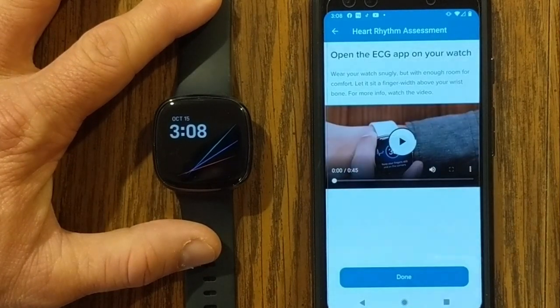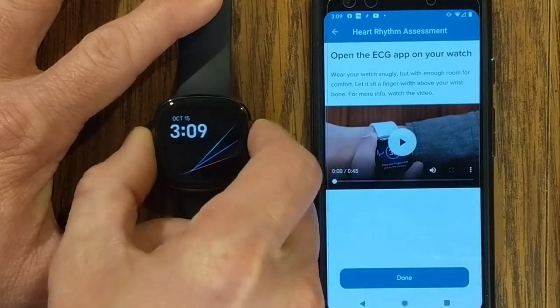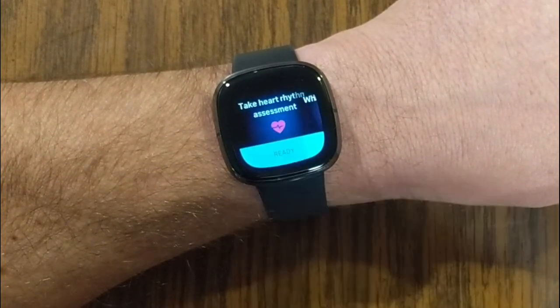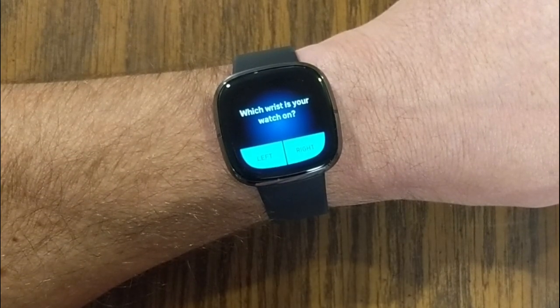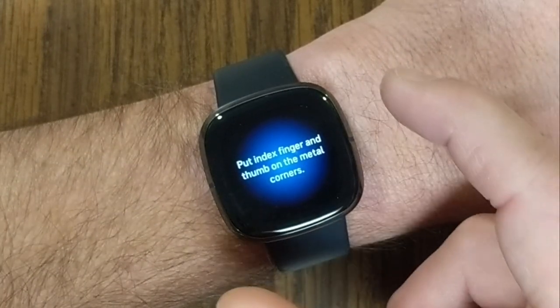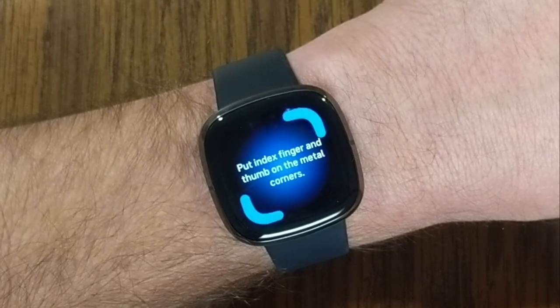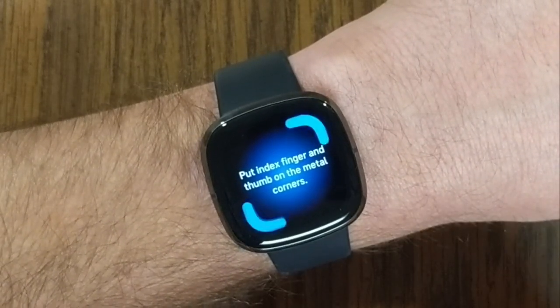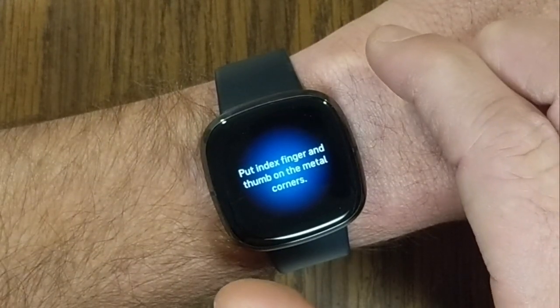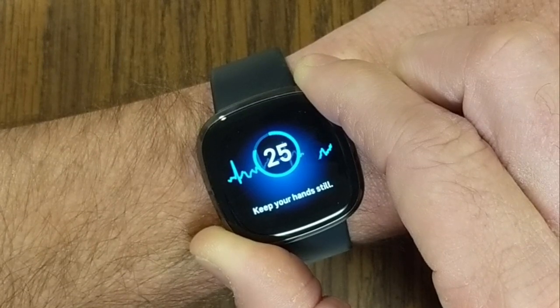They want you to have a diagnosis done by a doctor, but this is kind of a heads-up or warning. It gives you a video of what to do, but we're actually going to do that. With the Fitbit Sense on my wrist, I'm going into the ECG — 'Take heart rhythm assessment.' I'm going to click ready. It asks which wrist my watch is on — it's on my left. 'Have a seat, try to relax and keep your hands still.' I'm going to say I'm sitting and put my index finger and thumb on the metal corners. The Fitbit Sense has a metal ring going all the way around it, which is different from the Versa 3.